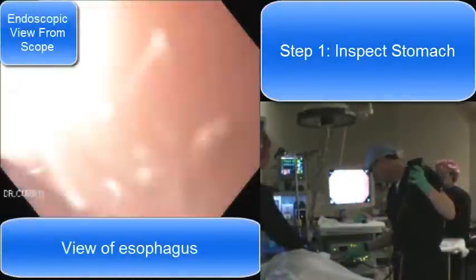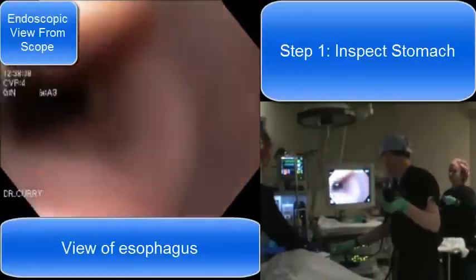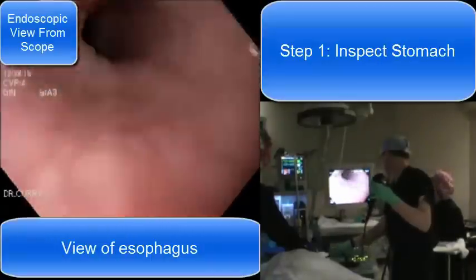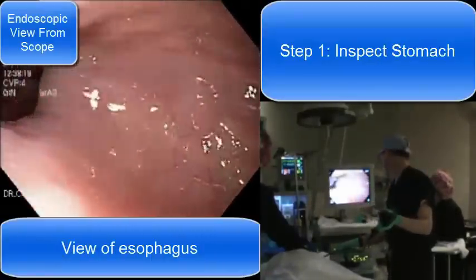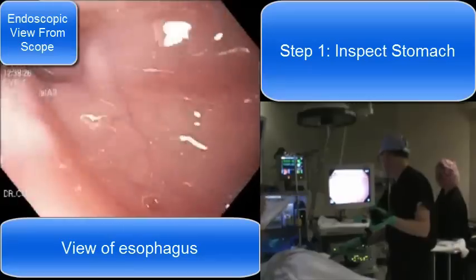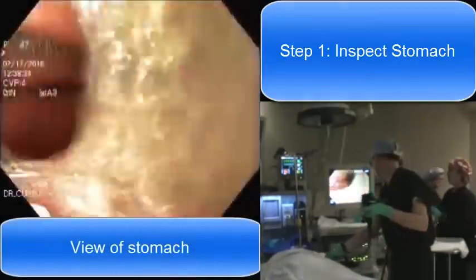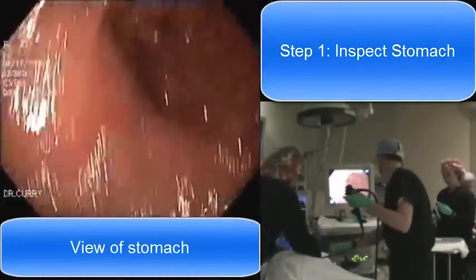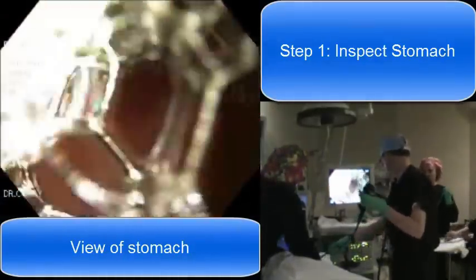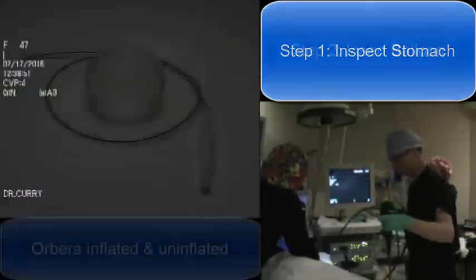Here you can see our setup with the patient on the table sedated. The first step is we insert an endoscope into the esophagus and advance it down into the stomach. We want to take a view of the stomach from top to bottom and make sure that everything looks okay before we decide to place a balloon. We blow a little bit of air in so that we can see everything nicely, and the patient is fully sedated so they're not aware of any of this.